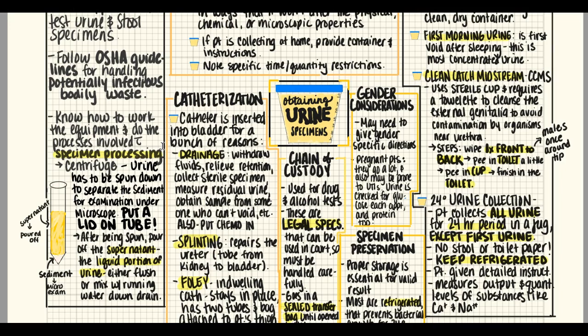And I drew a little picture here over to the side. It looks very beige or white, the sediment does. It's a very small amount, but you'll see they look like solid particles underneath the liquid portion of the urine. So then we pour off that supernatant, or that liquid portion of the urine. Usually if you don't pour it off, you pipette it off so that sediment doesn't get mixed back in with the supernatant. And then the sediment is what is tested, or examined, underneath the microscope.